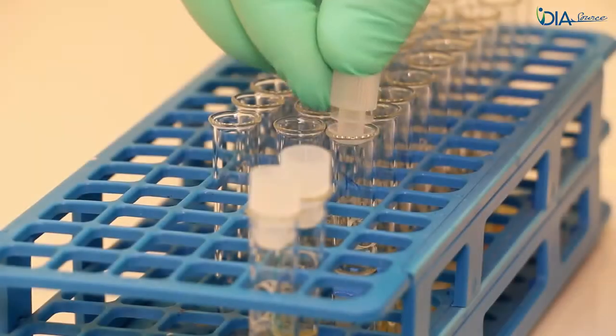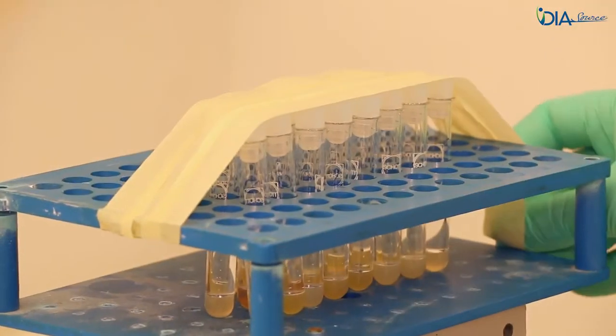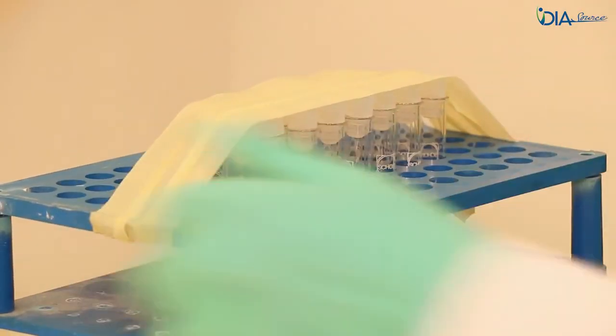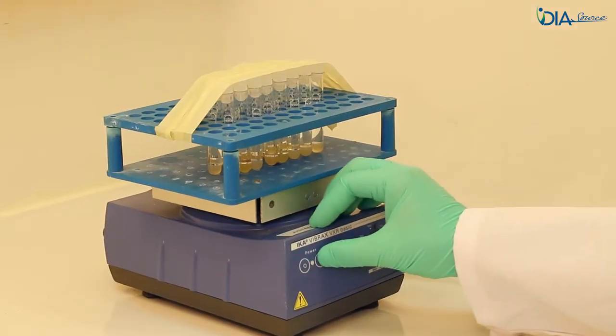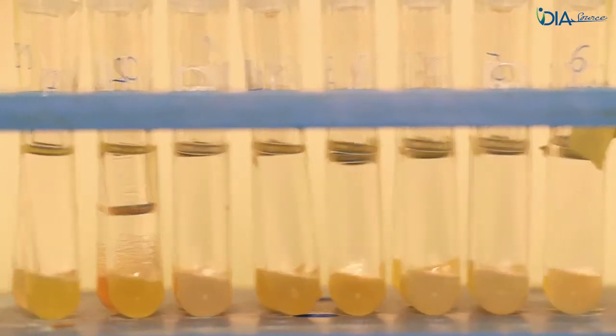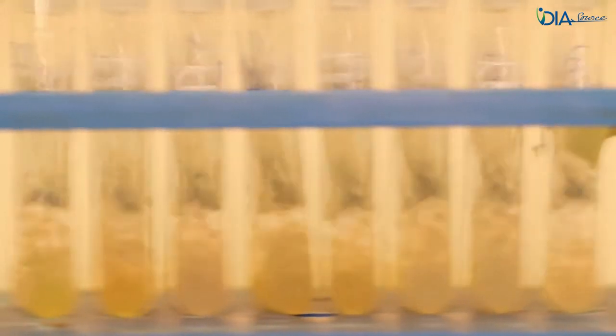Cap the extraction tubes and place them in the appropriate shaker rack by filling the middle of the rack. Secure the tube caps with tape and start the shaking at 1200 rpm. A lower or higher shaking speed will result in inefficient extraction or in inseparable emulsion.